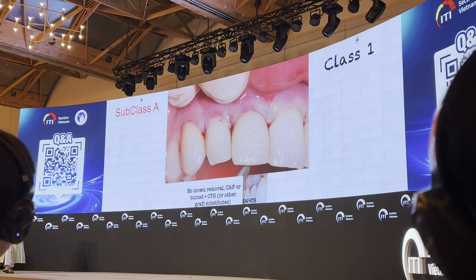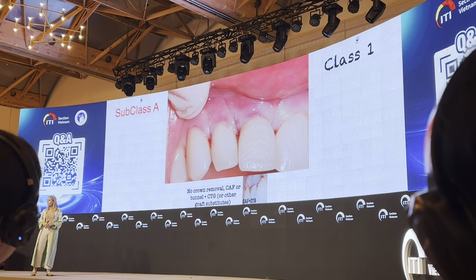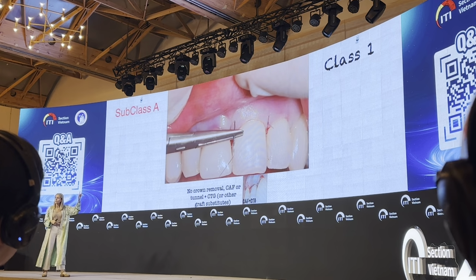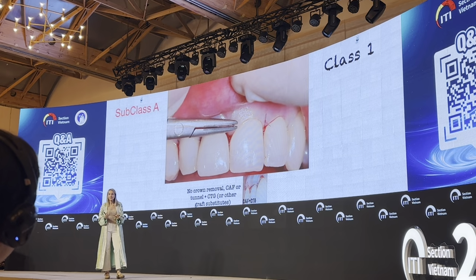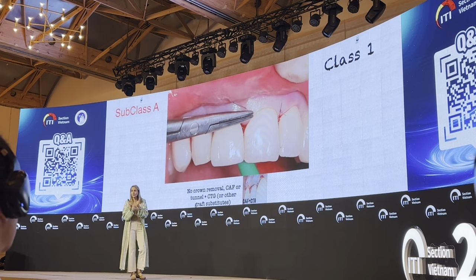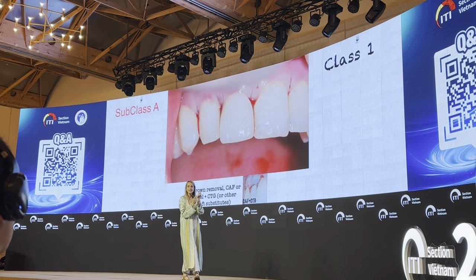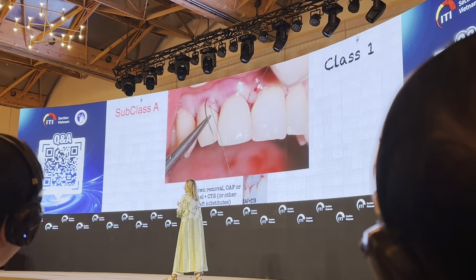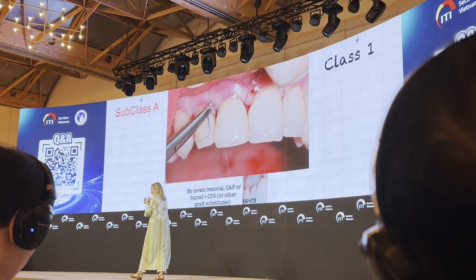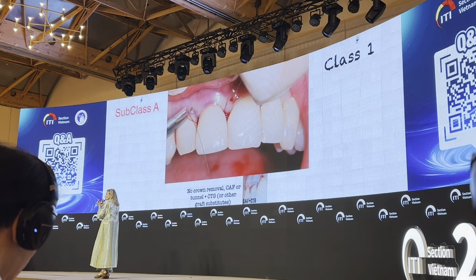So you see, when I pull the suture, I always use PGA suture material. Whatever suture you will see in the video, they are PGA 6-0 for the sling suture or 7-0 for the connective tissue graft. This is a resorbable material which has the characteristics to be resistant, but on the other side soft.